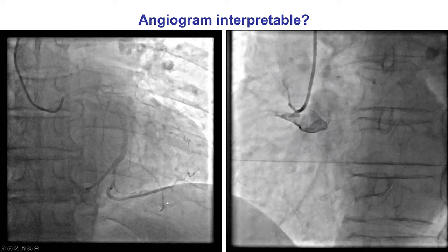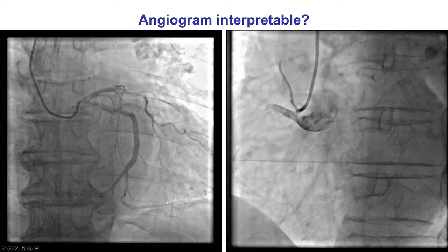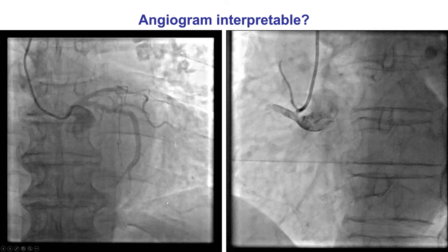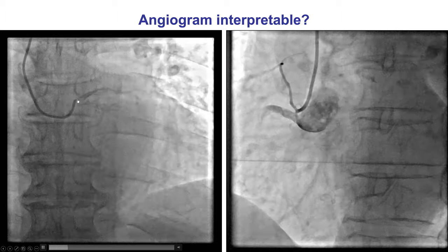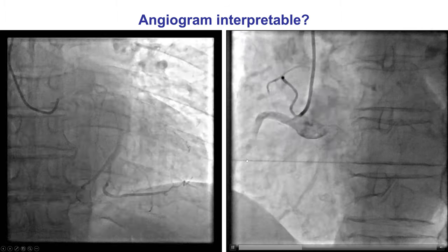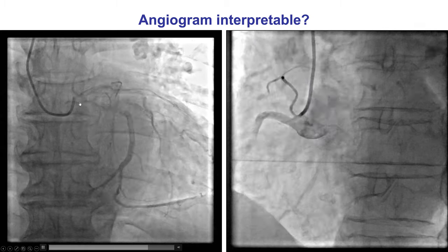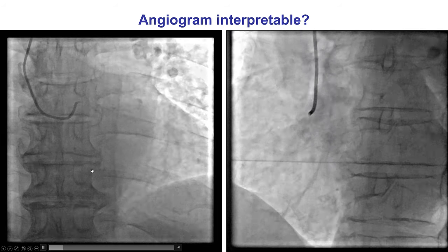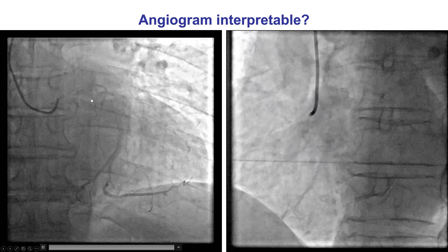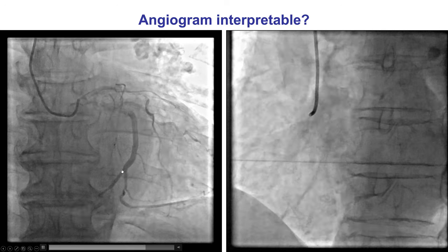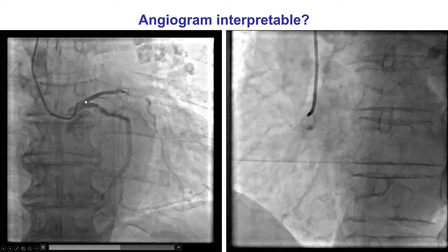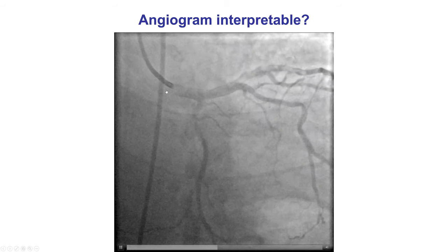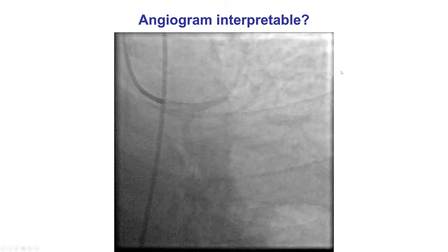The first question before proceeding with interpretation is to check whether the quality of the images is sufficient. Examples of angiograms of poor quality show poor filling of the coronary artery due to suboptimal engagement, making interpretation impossible due to incomplete opacification of the lumen. For the angiogram to be interpretable, there should be good opacification of the coronary artery, contrast returning into the aorta to check for osteal stenosis, and all coronary segments assessed in orthogonal projections.